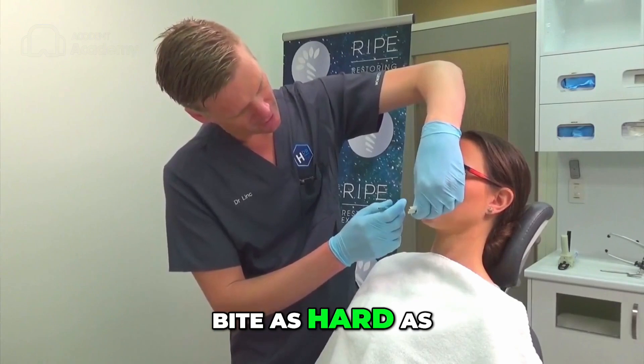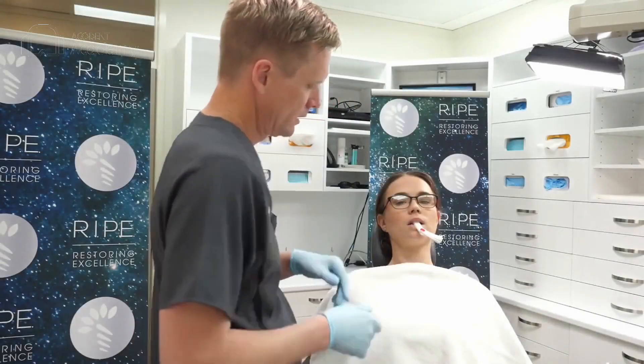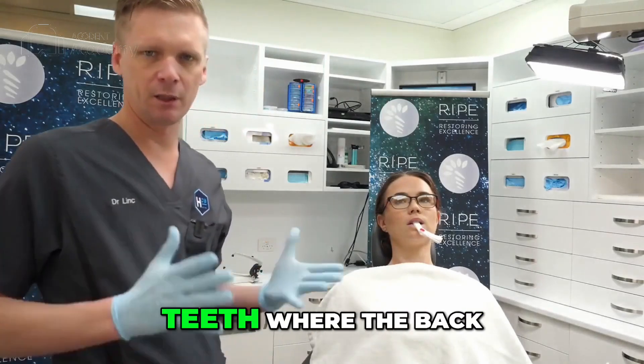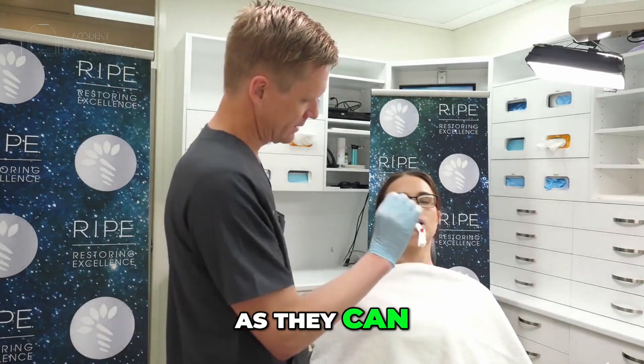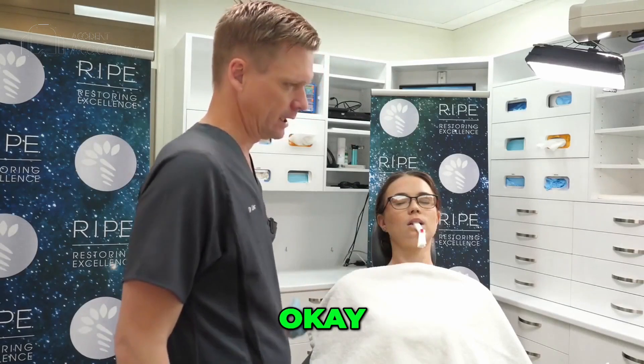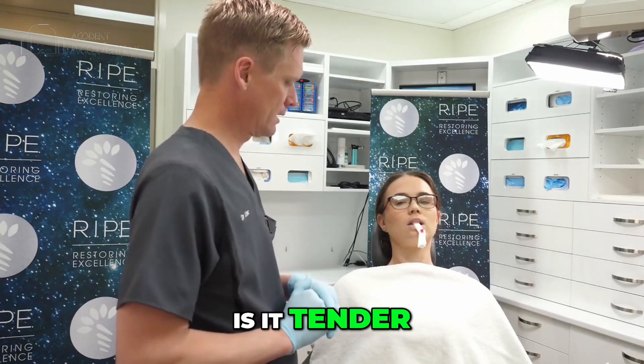Try it again. Bite as hard as you can. So now we've got a vertical dimension at the front teeth where the back teeth no longer touch. This is very important. Get the patient to bite as hard as they can. Now, if their lateral pterygoids are tense, it will actually be a bit tender. Is it tender?